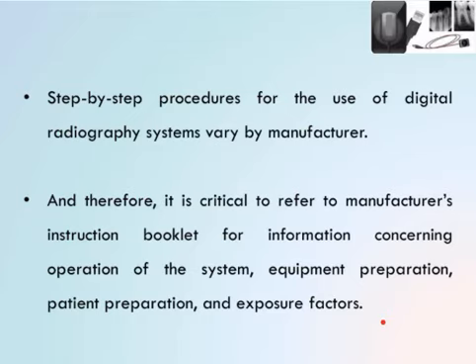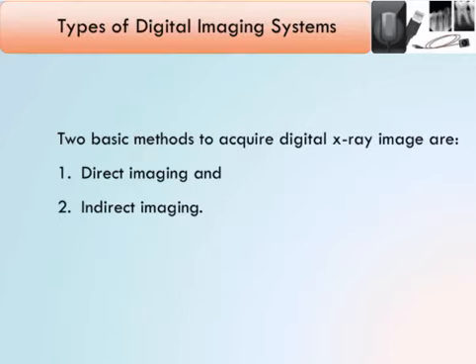So we have to always go to the sensor manual, especially if you are changing your workplace and going to a new location where you are practicing digital radiography. You have to know what instructions you have to follow to use that particular sensor from the particular company. That is important because the specifications may slightly change for each sensor.